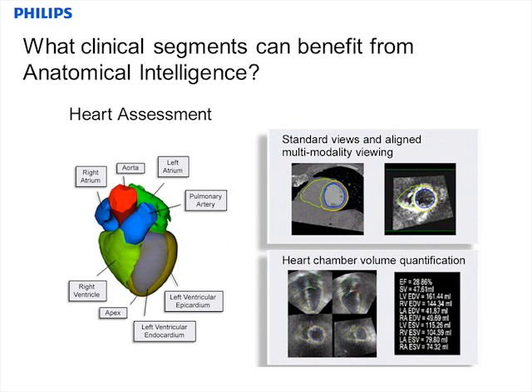How do you think it will be utilized? Any specific clinical segments? AIUS will likely be used to quicken examining 3D volumes to make sure more reproducible quantitative measurements can be made, and so that this can enhance image-guided intervention as well.